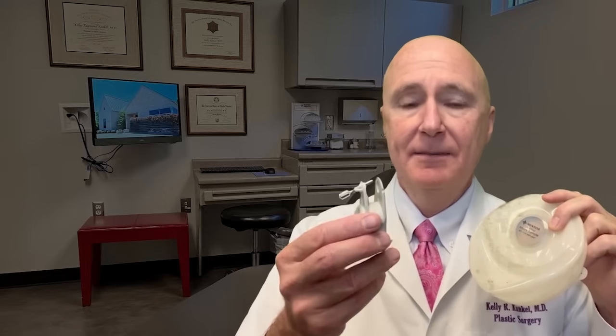I'm Kelly Kunkel, a plastic surgeon in Fort Worth, Texas. This is a tissue expander that we use in breast reconstruction. This is a magnet that's used to identify the port.